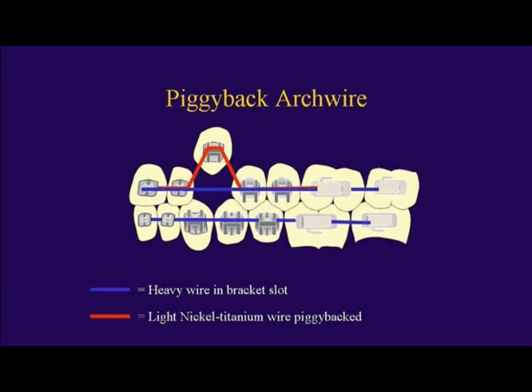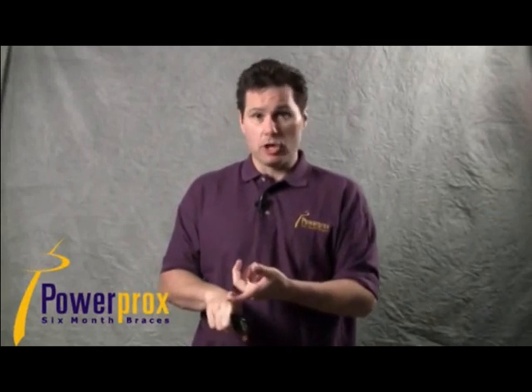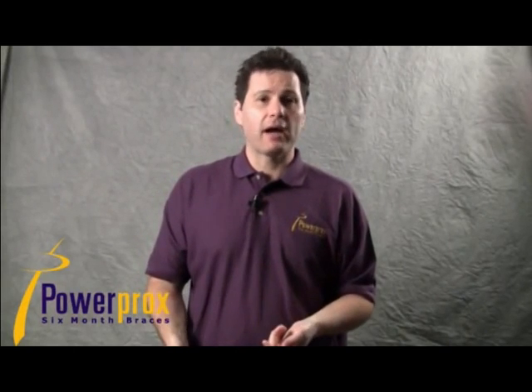Now, once it's come down a little bit from what you do with your knotted power chain, I like to use a piggyback arch wire. I like to have a heavier arch wire in the bracket slots bypassing the canine. You know, at least an 018 nickel titanium, even an 018 steel is a great wire for this. And then I typically use just an 014 nickel titanium as my piggyback arch wire.